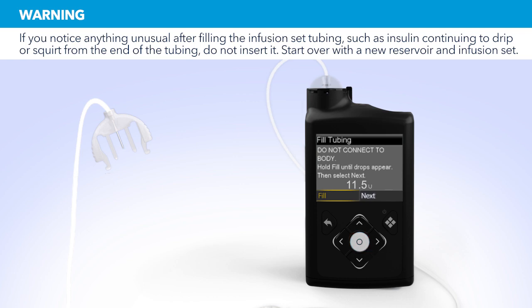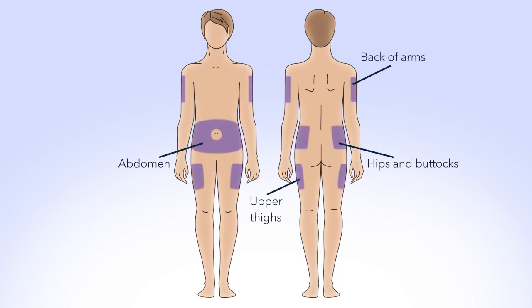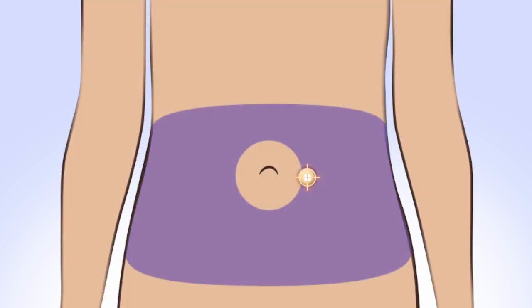Now press Right and select Next. Choose an insertion site from the shaded areas. Be sure to avoid the 2-inch area around your belly button, any hardened or scarred tissue, and the previous site you've used. If you give insulin repeatedly in the same area over a long period of time, it can cause the tissue to thicken and insulin won't be absorbed properly.